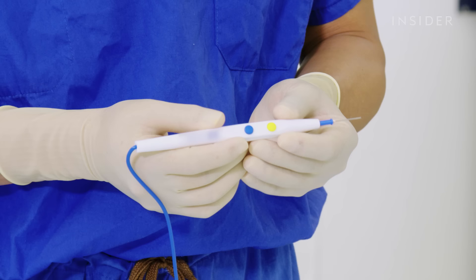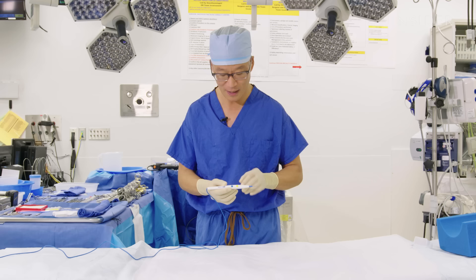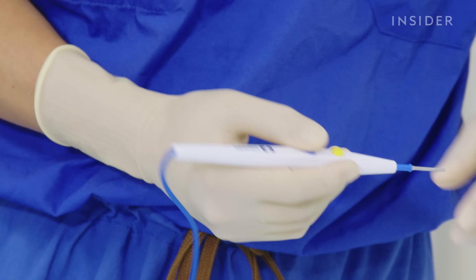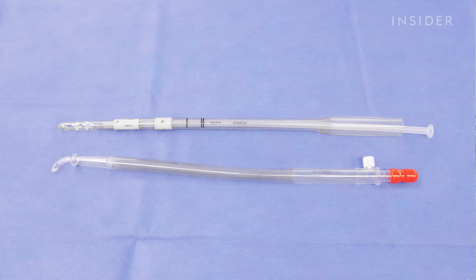Then we use what's called the electrocautery bovie. This is one of the stars of the show, as well as one of the most commonly used instruments in all of surgery. This instrument allows us to both cut through tissues as well as cauterize small blood vessels so we can operate in a relatively bloodless field.